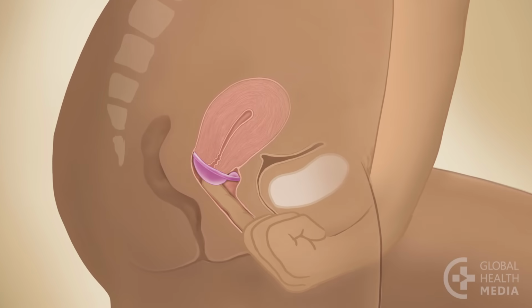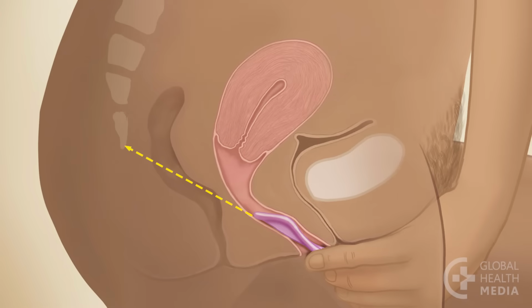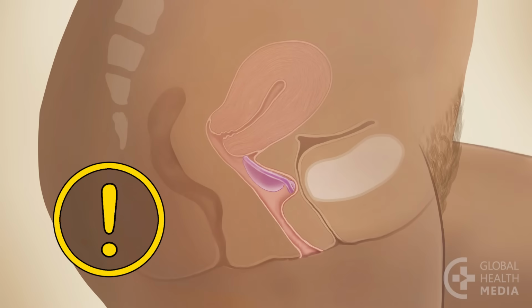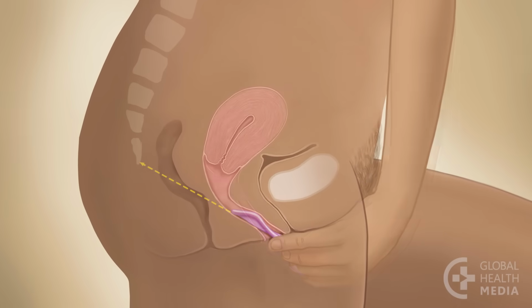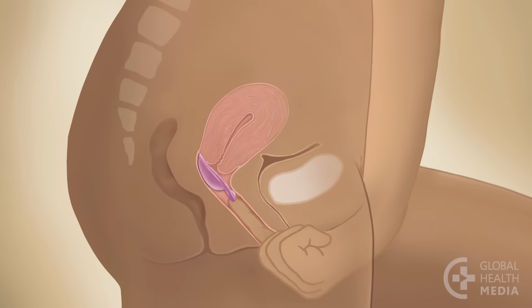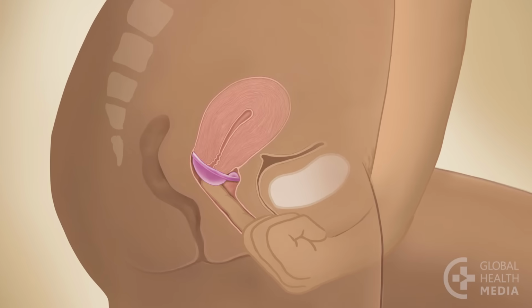Now, feel for your cervix within the diaphragm. If you don't aim the diaphragm toward your tailbone, it may not be positioned in the right place. If your cervix is not covered, take the diaphragm out and try again, aiming the diaphragm towards your tailbone. Your finger may not reach your whole cervix, but you should have a good sense that the diaphragm covers it completely.